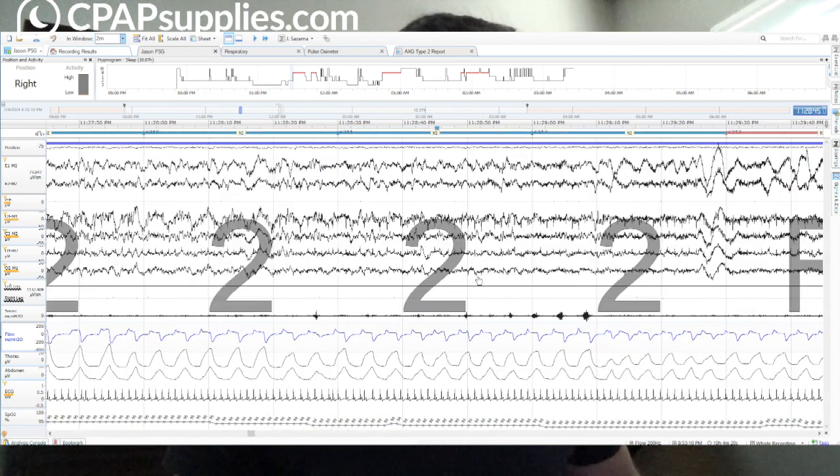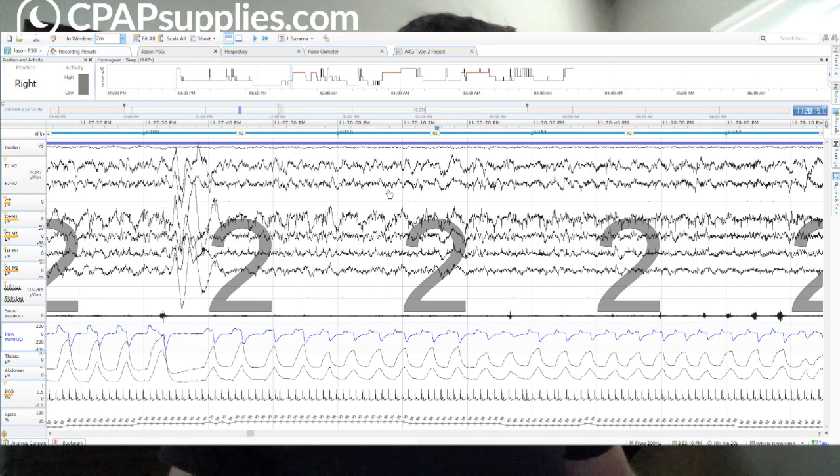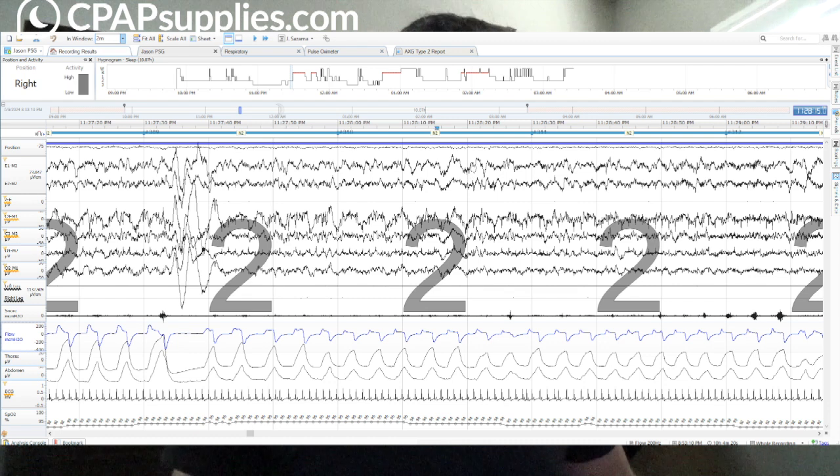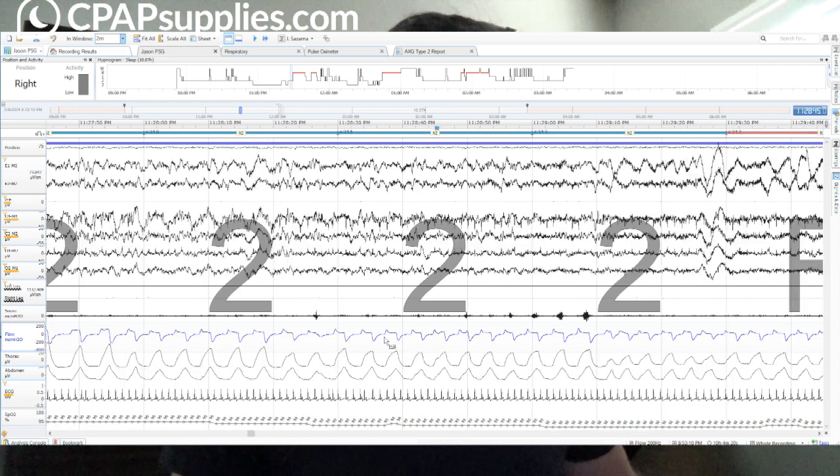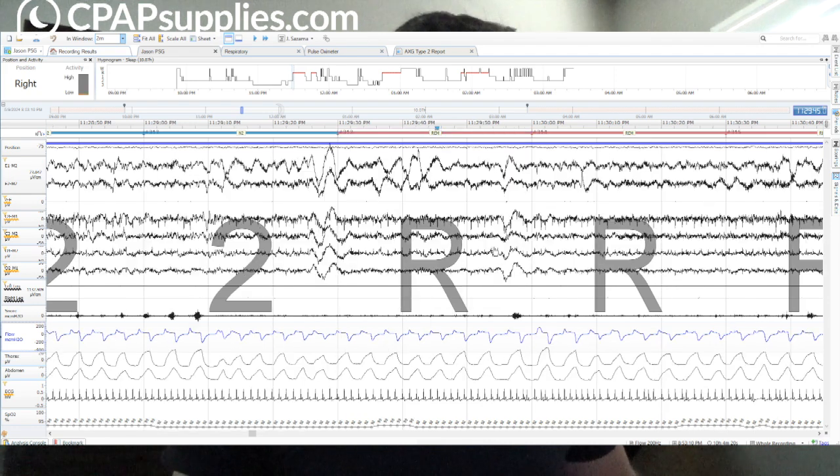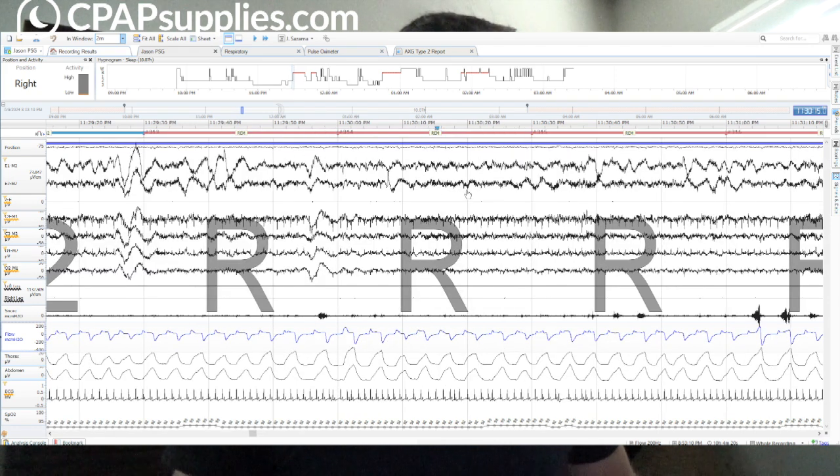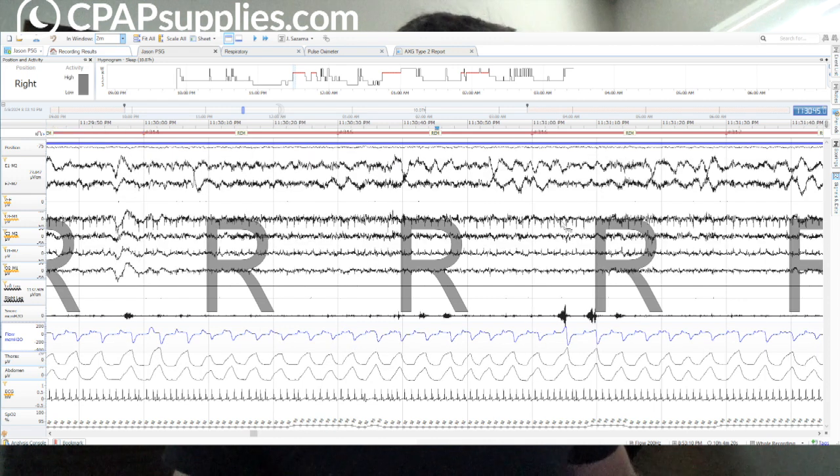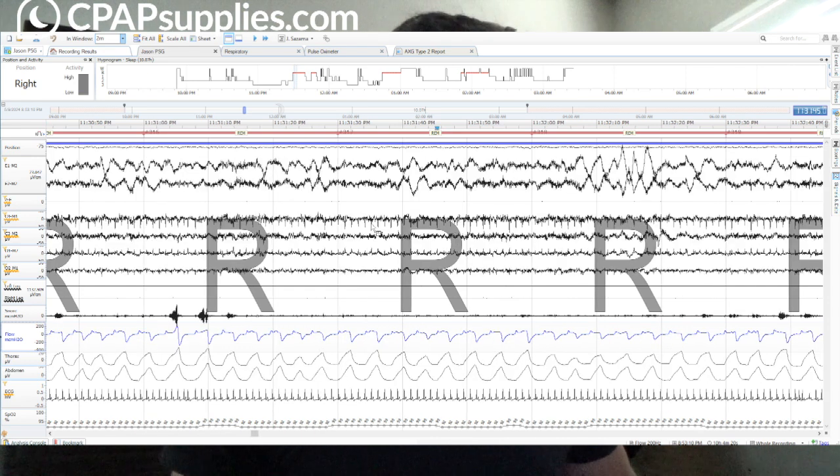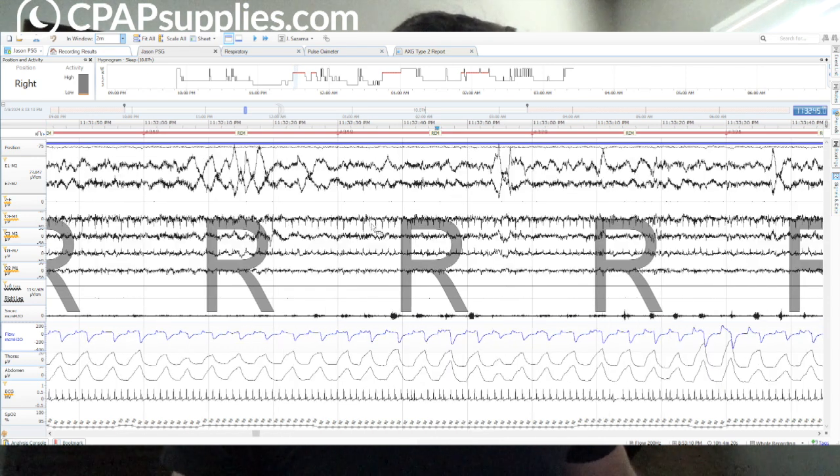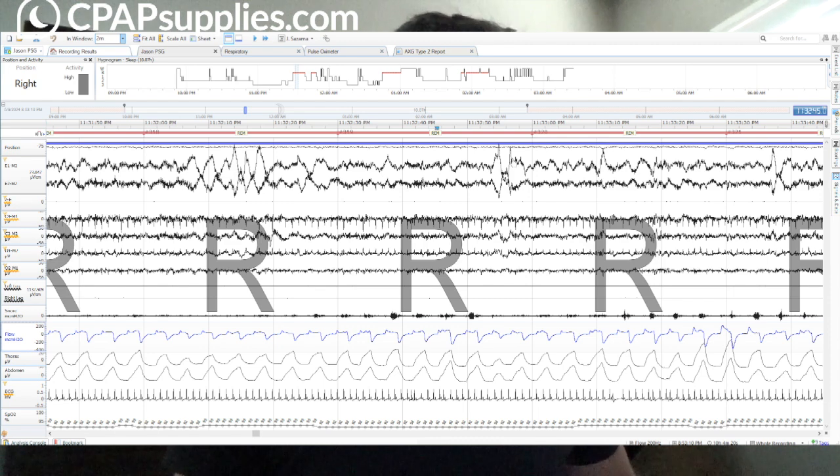All right, now we have REM. Let's do this. So look at the waves. You have the eyes that are kind of synchronous somewhat, kind of more picking up like EEG. And then you have like the breathing is pretty flat. Then all of a sudden we see this transition where now all of a sudden the eyes are asynchronous. They're kind of doing the exact opposite of each other. And the EEG has toned down a lot. It's really flattened out. Now you see some more sharp eye movements, like really sharp. And they're rapid. Rapid eye movement.